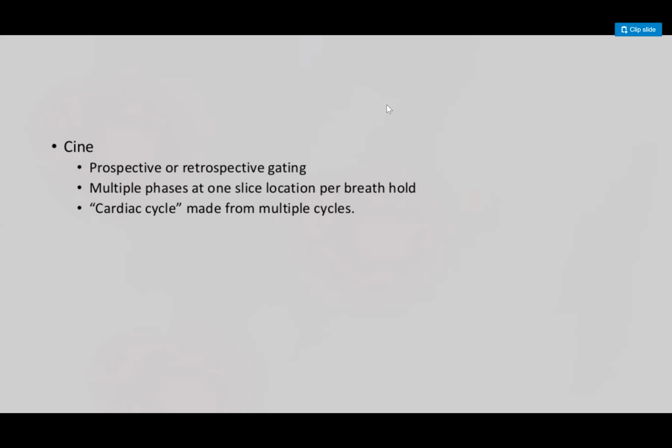So is it fair to say that the spin echo black blood is primarily T1? Yes. Okay. That's kind of what I had in my mind, but I wasn't 100% sure. Okay, thanks.